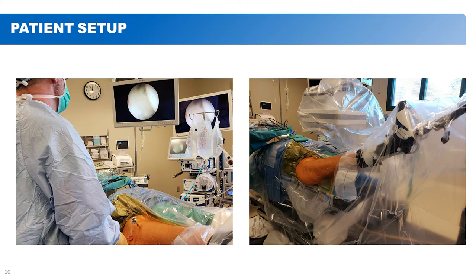If you do have a torn labrum and you fail conservative care like anti-inflammatories and physical therapy, which Kathy's going to talk about a little bit later, sometimes it necessitates surgery. This is actually me in the surgery room, and you can kind of see the setup. It's pretty complex, obviously. We've got a special table that helps distract the leg to pull the thigh bone away from the pelvis so we can safely get into the hip joint and enter in and see.